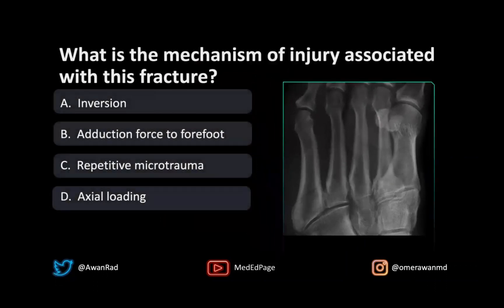I hope everyone sees this lucency here. This is along the base of the fifth metatarsal. There is a fracture here — it's a comminuted non-displaced fracture. It's non-displaced because we don't see fracture fragments displaced anywhere, but it is comminuted because we can see a fracture line there, a fracture line there, a fracture line there — certainly more than two parts.